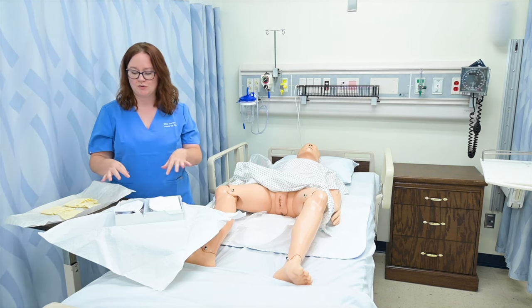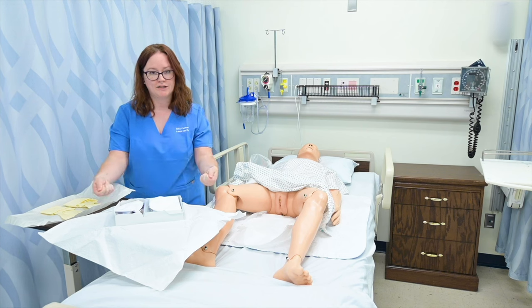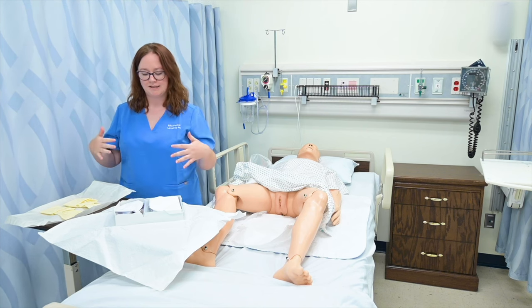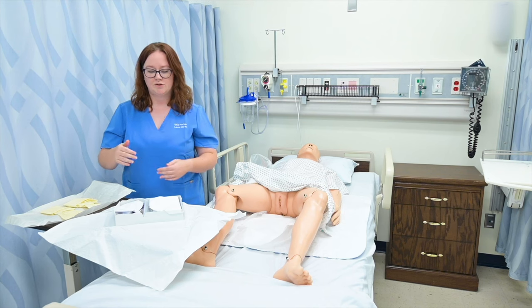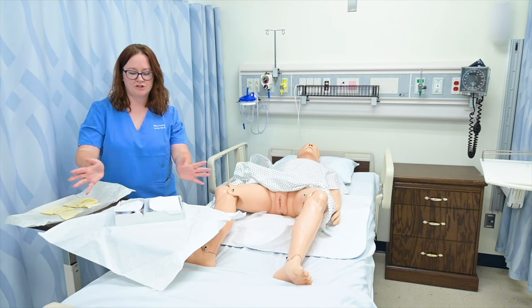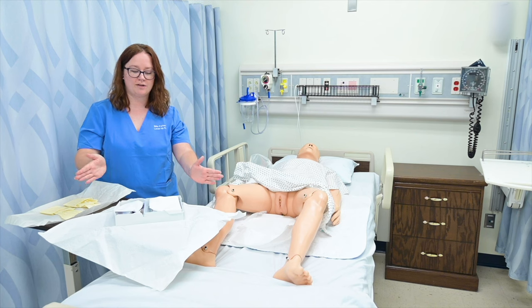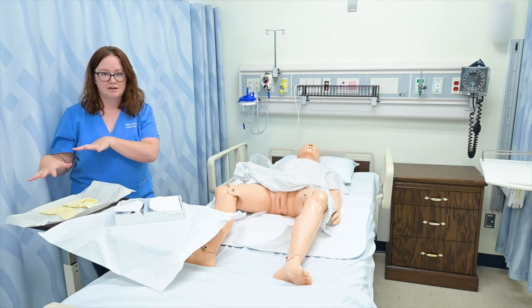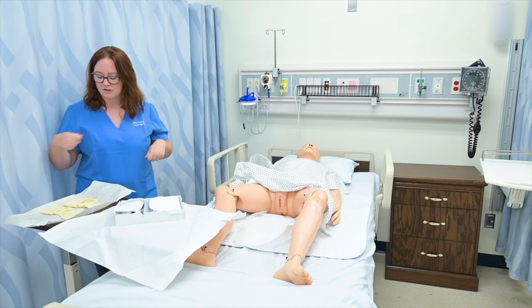This is an error I see students do a lot: they'll open the sterile package over their sterile field or have it right here on the edge, and that means they're already contaminating that field. So I like to position this initial sterile field at that angle so that when I open it, I have left space here for my sterile glove packaging.